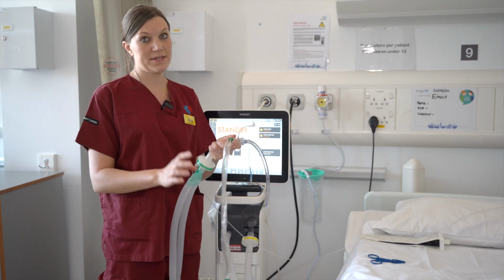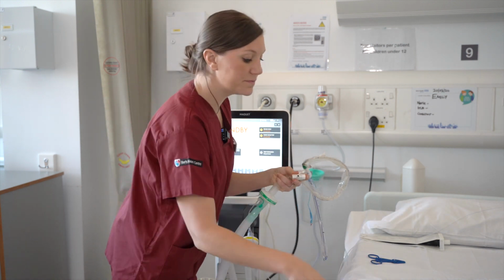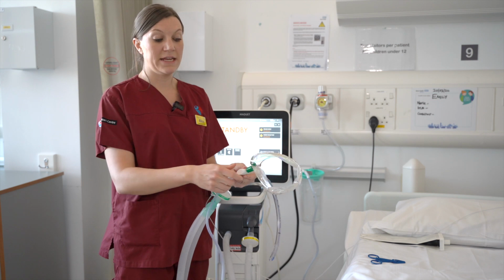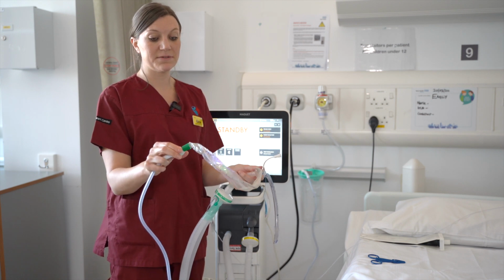To apply your suction and suction the patient, you remove the cap from the end of the suction, attach your suction from the wall. You then need to lift and twist the cap, allowing it to be depressed.